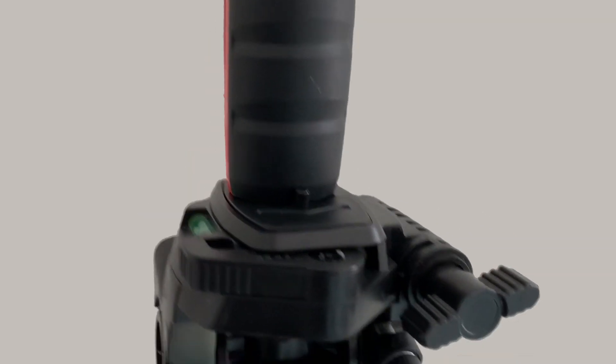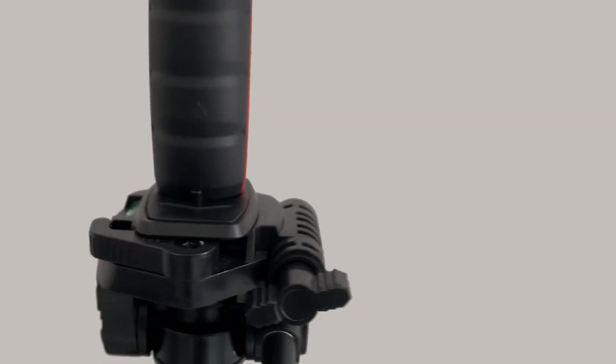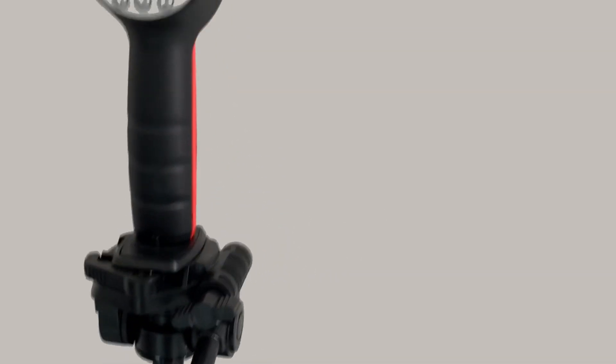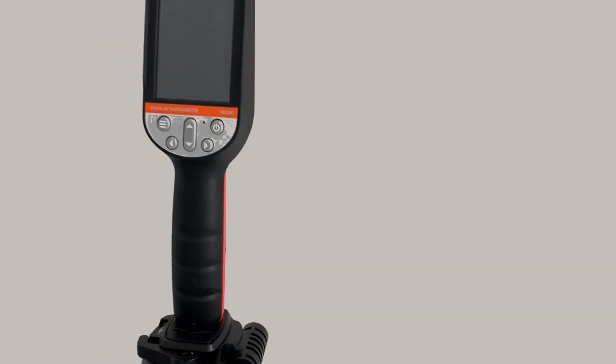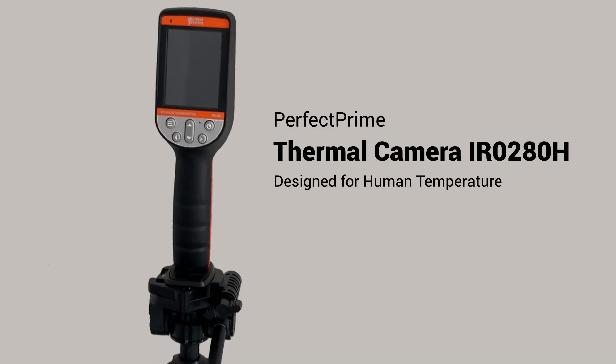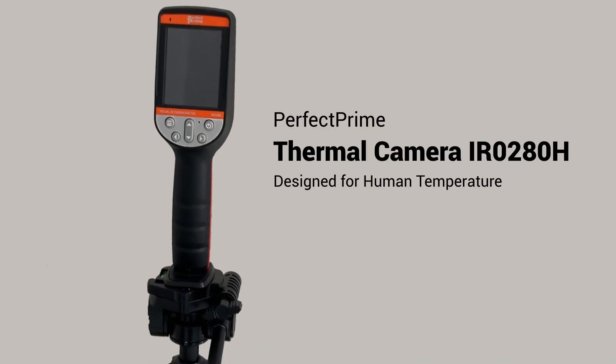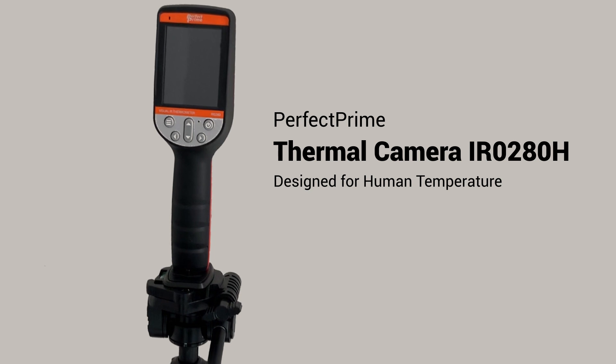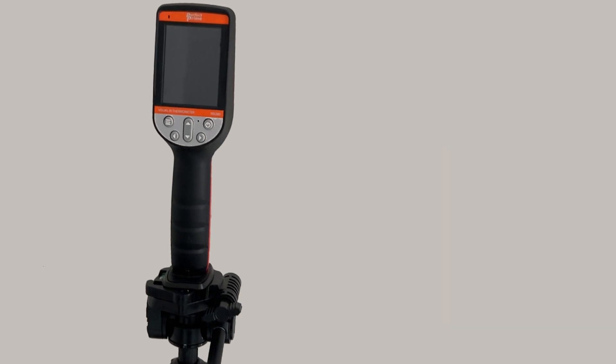In addition, it has an alarm feature which users can set what temperatures to sound an alarm alerting the users. We will demonstrate how to use Perfect Prime Thermal Camera IR0280H to detect human body temperature.